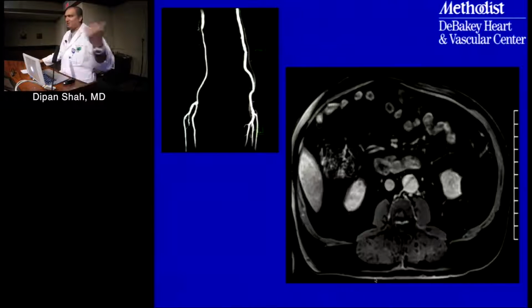Yeah, from a diagnostic standpoint, I talked about that last time when we talked about lower extremity runoffs. The diagnostic accuracy for MRA in pooled data depends again on which level you're talking about. At the aortoiliac level, it's probably in the mid 90% range. At the popliteal, femoral, and SFA level, it was like 98%, and then at the infrapopliteal level, the sensitivity and specificity was in the low 90s range. And the CT data also, I think, is fairly comparable. The challenge with CT, if you have a lot of calcification, is that it can be hard to identify the true extent of stenosis. And I'll let Sumin talk a little bit more about the diagnostic accuracy of CT. But in general, I think they're pretty well established. I think the infrapopliteal is a little bit more challenging because they're smaller vessels, so you start to run into resolution issues. But for the aorta, the iliac, and the femoral, you're at 90+% sensitivity and specificity. And again, all of these were done using X-ray angiography as the reference standard.